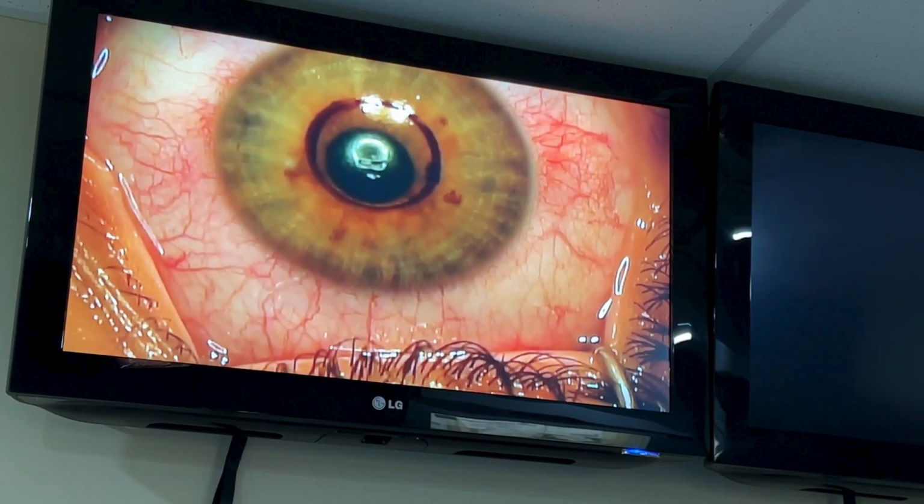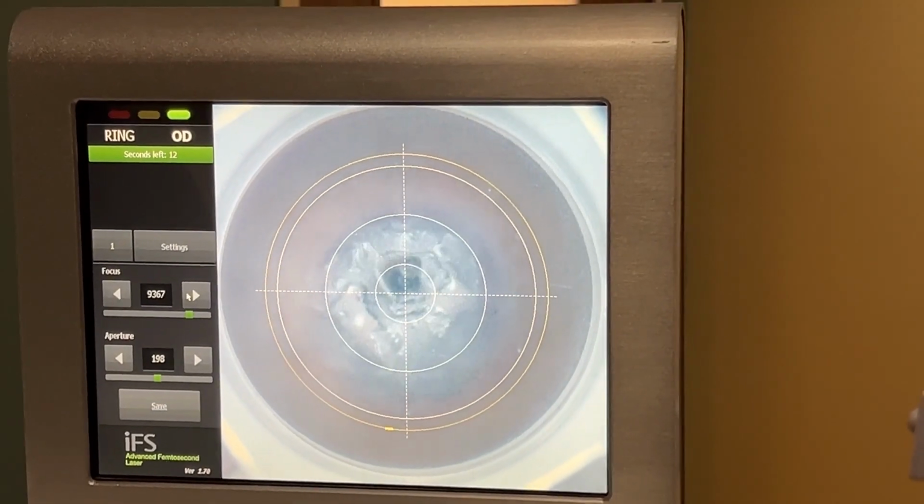And then when I see those 3 marks, inferior, infratemporal, and so forth, I put that optical zone stamp on top of it, and I've got a nice ring that's gonna guide my femtosecond laser to cut exactly where I want it to. So you can see here, it's decentered inferior, right? And that's my goal. Here we are under the femto laser.